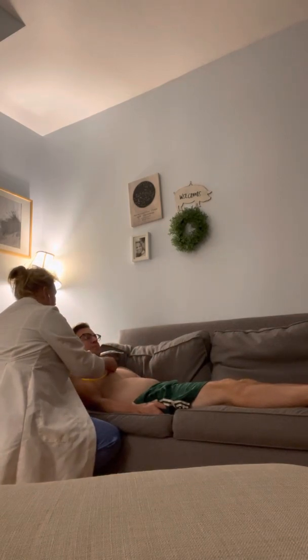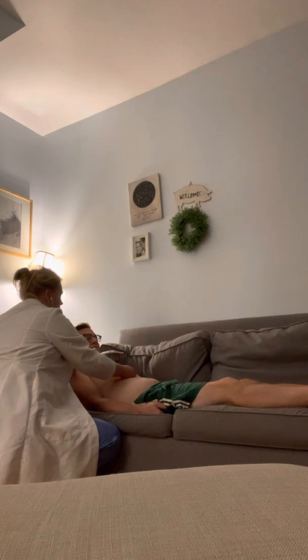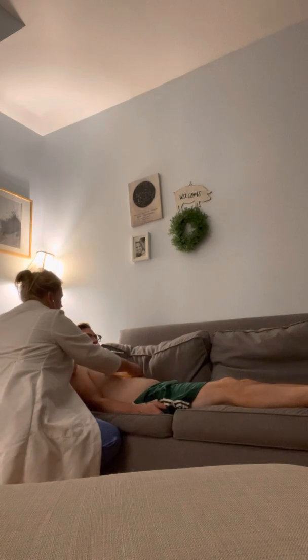Again, same areas, so aortic, listening for murmurs. Pulmonic. Erb's point. Tricuspid. And mitral.